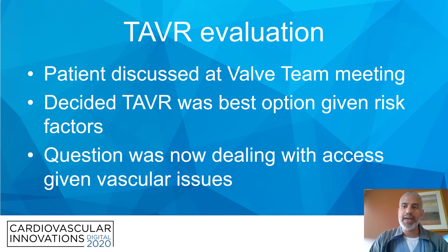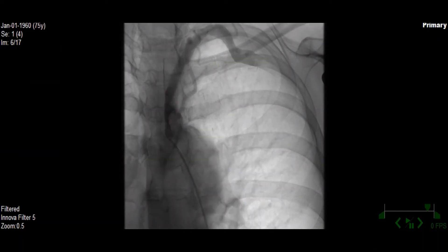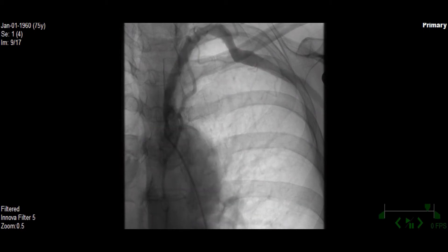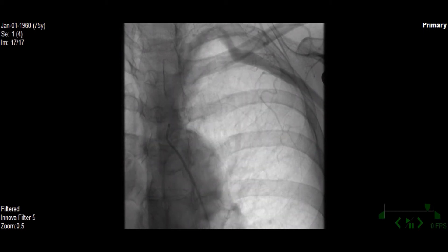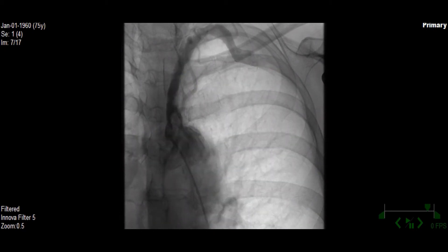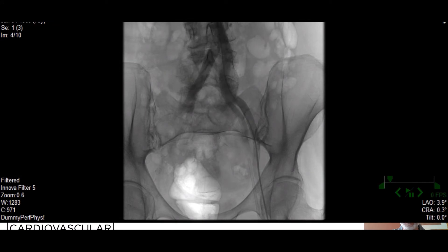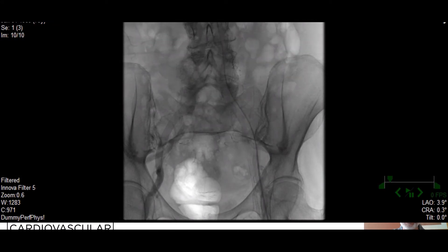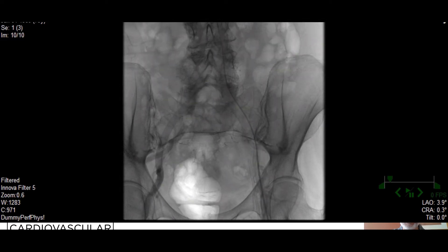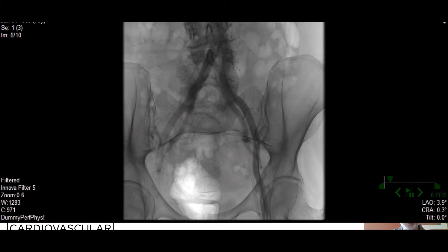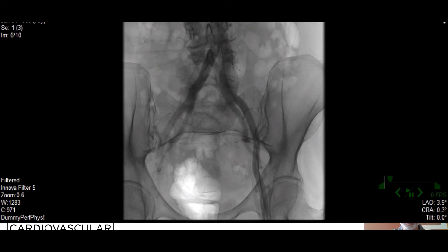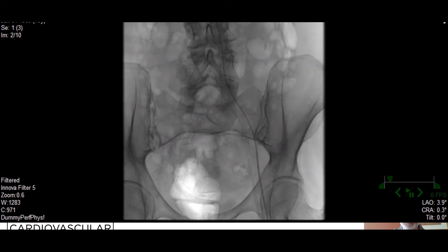The question was now dealing with access given her vascular issues. Here is an image of her left subclavian artery. The angiogram clearly shows at the ostium of the left subclavian a high-grade stenosis. There's also narrowing across the left clavicle area as well. On the aortic-iliac angiogram, in the right common iliac area there is another chunk of calcium which on digital subtraction imaging showed that this was quite narrowed. Luckily, the femoral arteries bilaterally were healthy, at least on the left side, which would give us a straight path into the aorta.